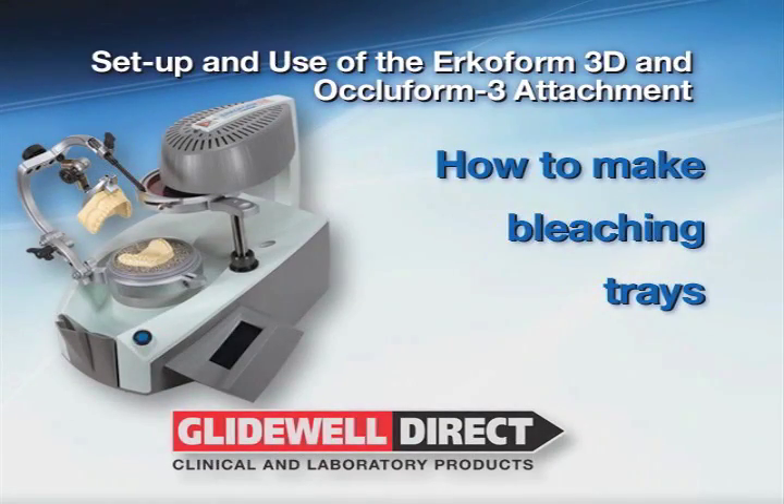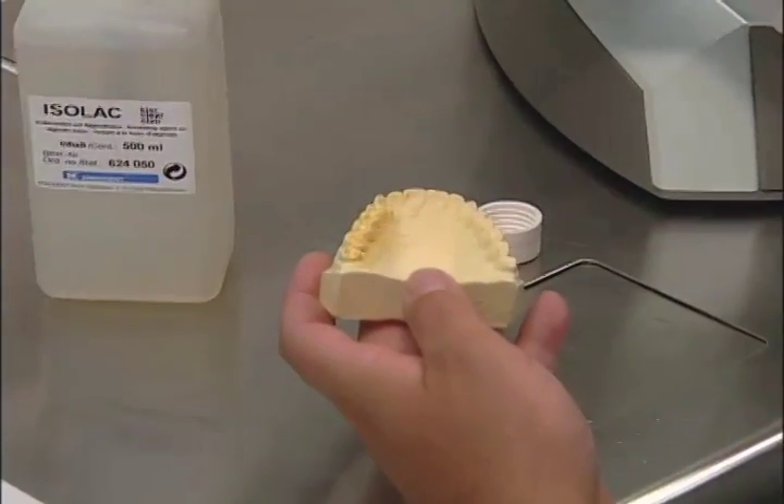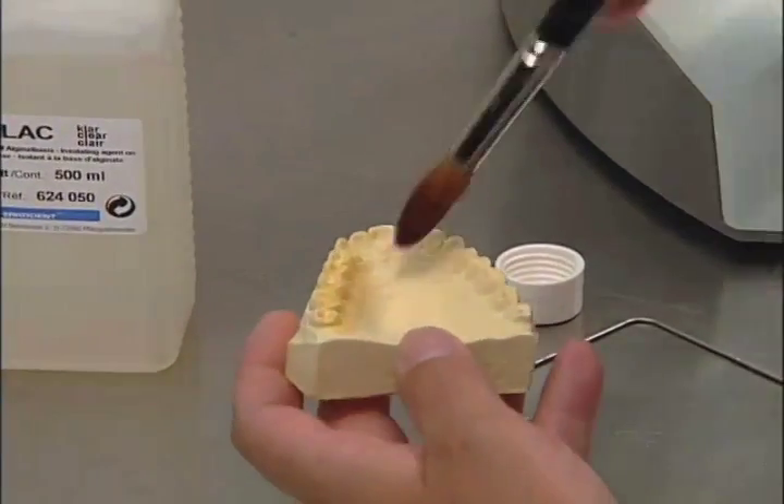How to make bleaching trays. First, using the Isolac isolating material, paint the model liberally with the solution.